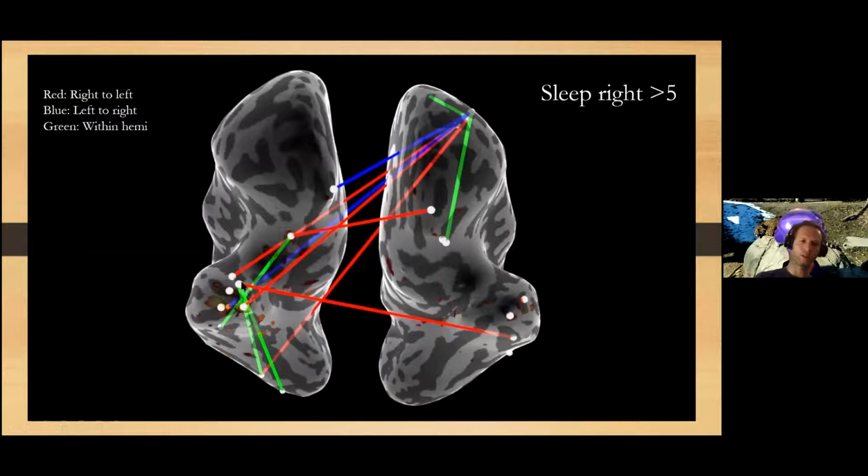So in this right hemisphere, the clusters are here. Again, we see the disconnection between those two clusters, this is red, so right to left, and also for here. But we also see an inter-hemi connection from the node of the clusters to the occipital lobe. And this is highly interesting because, as Valia mentioned, this patient has some kind of hallucination or a visual activation that occurred only while she was in her seizures.